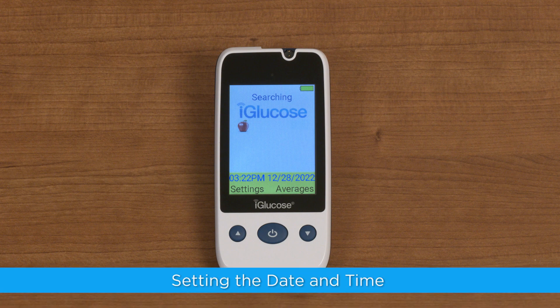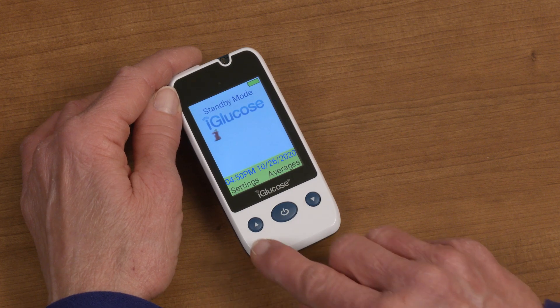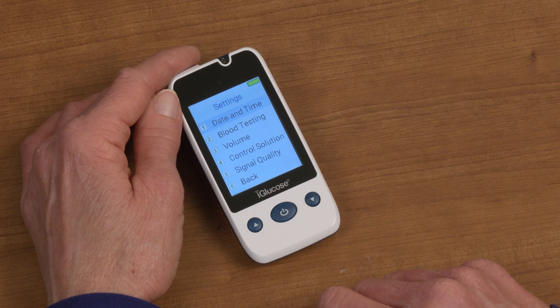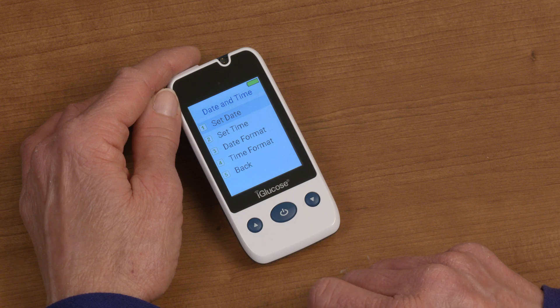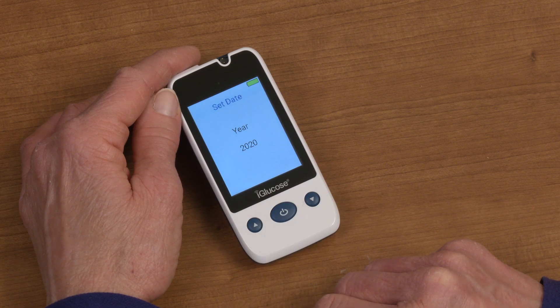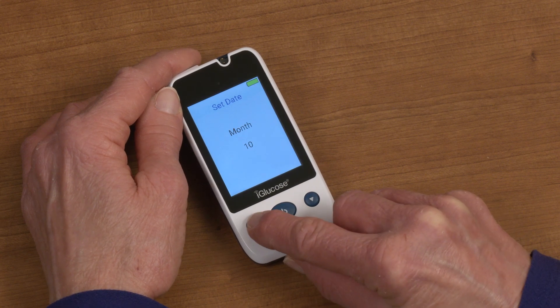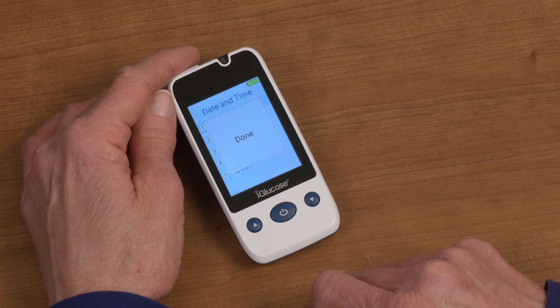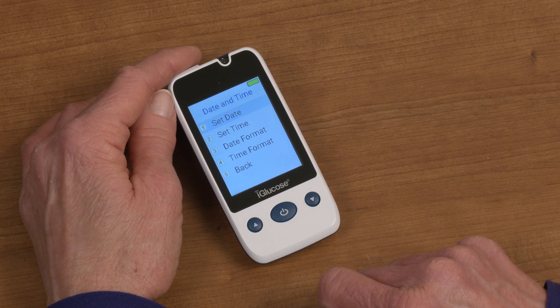Because your iGlucose is connected to the AT&T cellular network, the date and time are automatically set when the device turns on and connects to the cell network. If you would like to manually set the date and time, press the up arrow to access the settings menu, then select the date and time option using the up and down arrows and press the home button to select. Once you are in the date time menu, select the set date option. Use the home button to select and then use the up-down arrows to change the year, month, or day as necessary. Once you have entered the desired date, press the home button. A done message will appear on the screen. Repeat these steps for any other changes you need to make to the time or the format. To exit the settings menu, use the up-down arrows to scroll to the back option and press the home button to select.